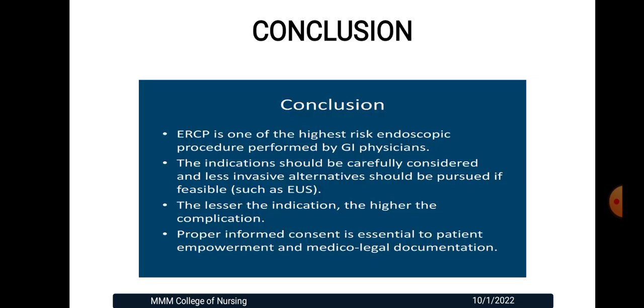Coming to the conclusion, ERCP is one of the highest risk endoscopic procedures performed by a GI physician. The indication should be carefully considered and less invasive alternatives should be pursued if feasible. The weaker the indication, the higher the complication. Proper informed consent is essential to patient empowerment and medico-legal documentation.